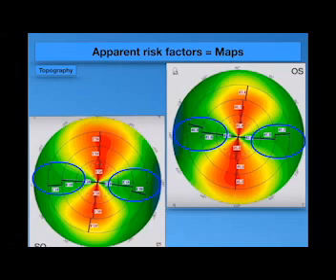So I can consider a difference of up to 2.5 between the superior and the inferior. That is normal, especially if I found on the slit lamp a corneal pannus or subepithelial vascularization and fibrosis after trachoma. So to skip this slide, the lower one, I put it inverted to tell you that there is a difference between the inferior and superior. If we invert it, it will be accepted if the difference is more than 2.5.